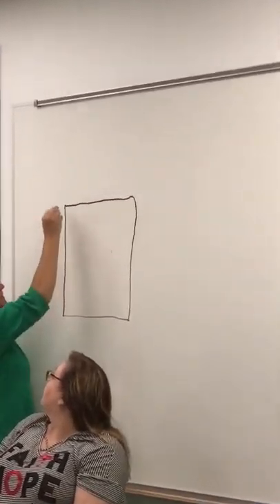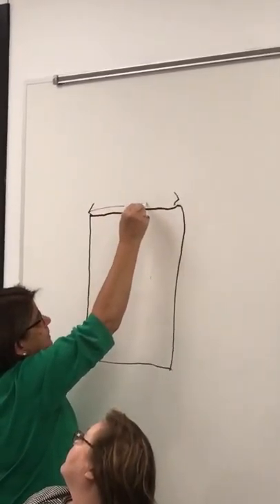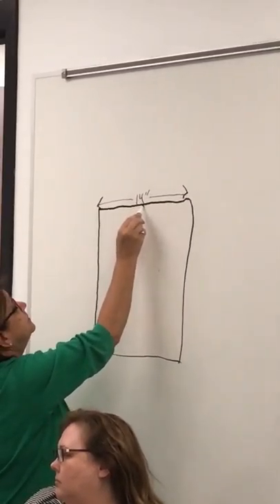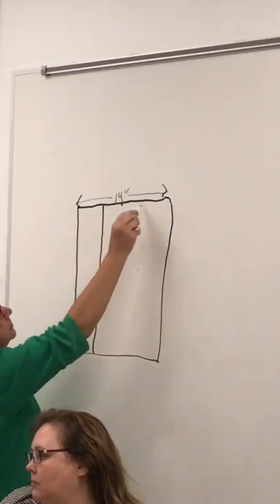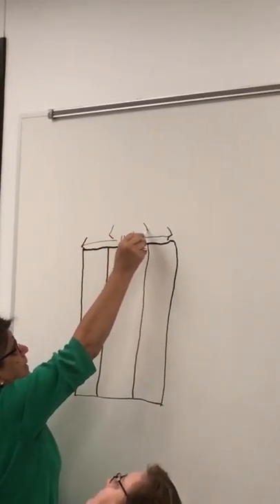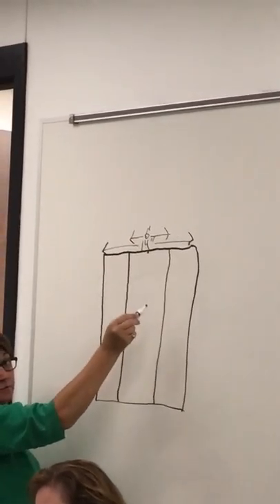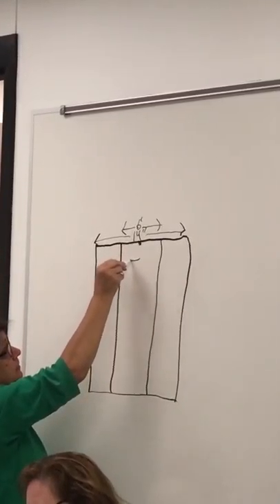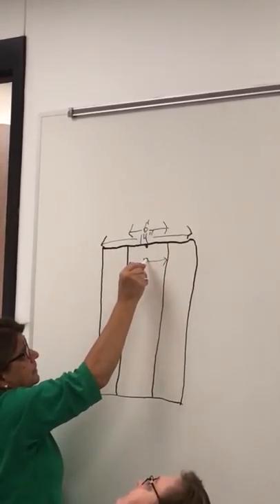Okay, so here's your 14 by 17 inch IR. This dimension all the way across, we know, is 14 inches. So let's say this is the center of your IR. Then this is your 6 inch collimation. So this is 6 inches of light. This is the center of your IR. So from the center, either way, is 3 inches.